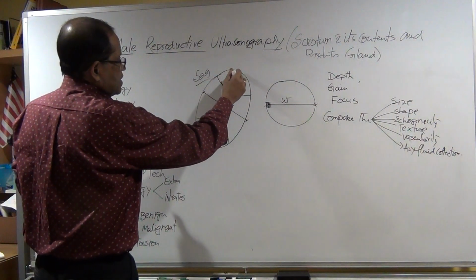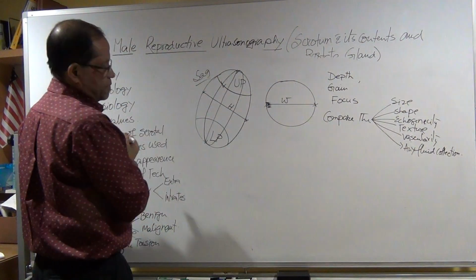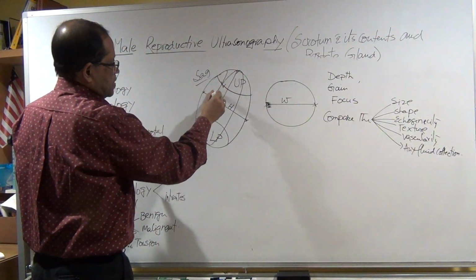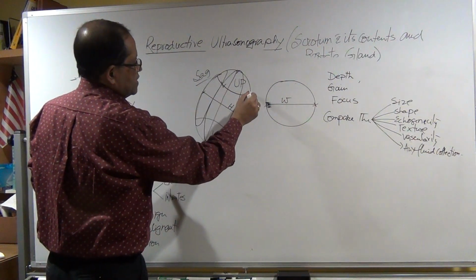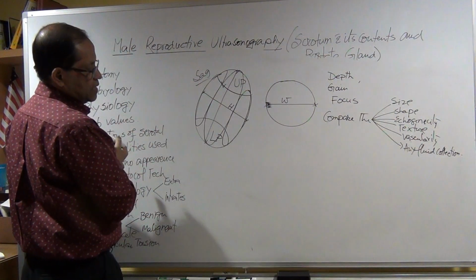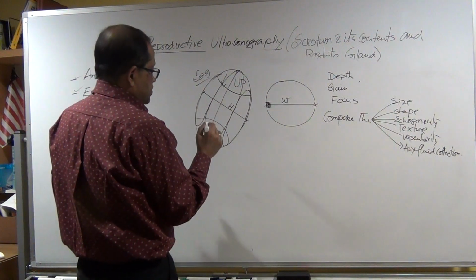And this is sagittal mid, and this would be sagittal lateral, this would be sagittal medial.